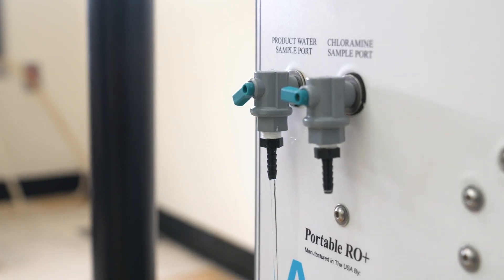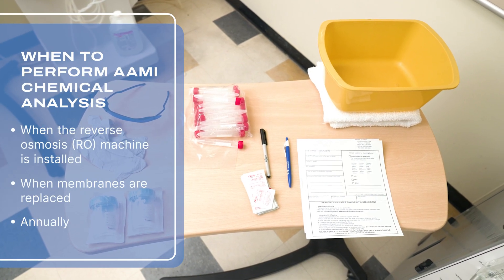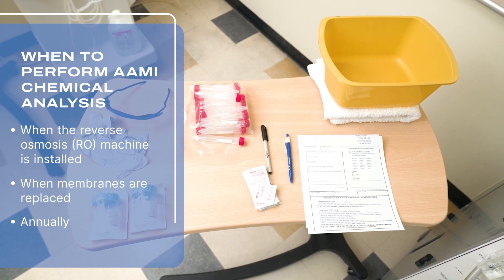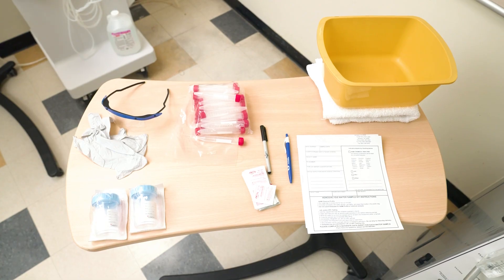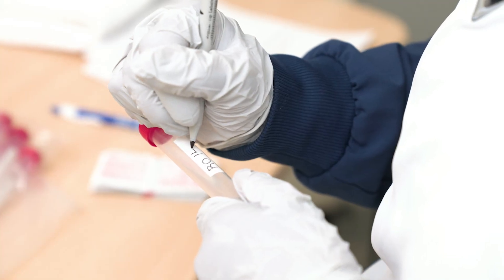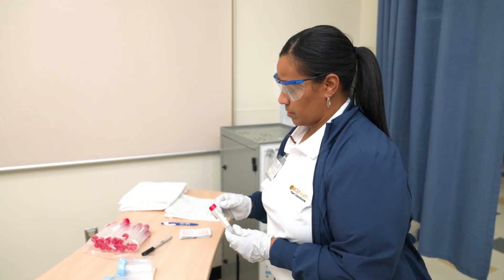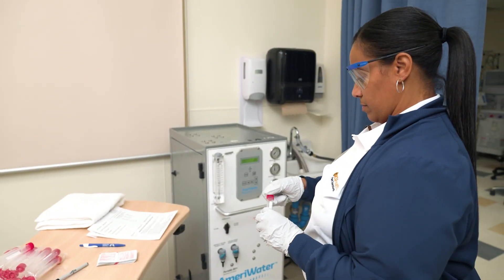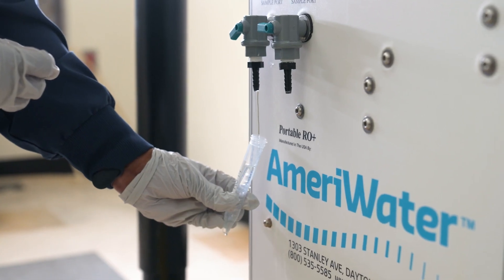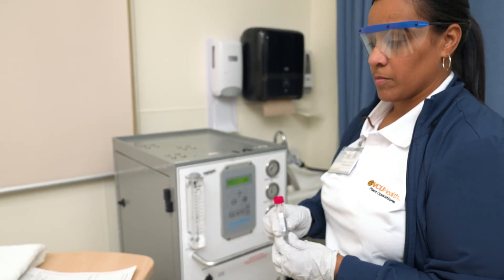AAMI chemical contaminant testing is done when the reverse osmosis machine is installed, when membranes are replaced, and annually. The sample should also be collected from the same Product Water Sample Port. Grab the sterile tube, label it with the name of the RO machine you're testing — this tube will be used for bacteria and microbiological and endotoxin testing. Uncap the test tube and take your sample using the clean catch method. Once the test tube is filled, replace the cap and turn the tube upside down once to ensure there is no leakage.